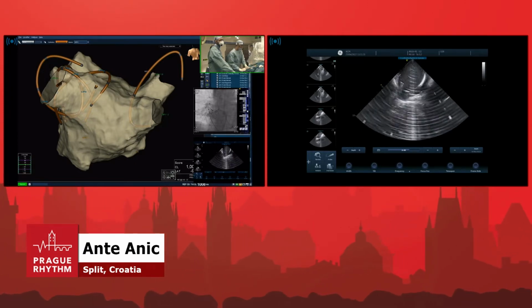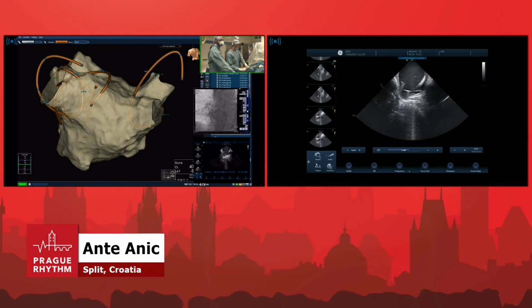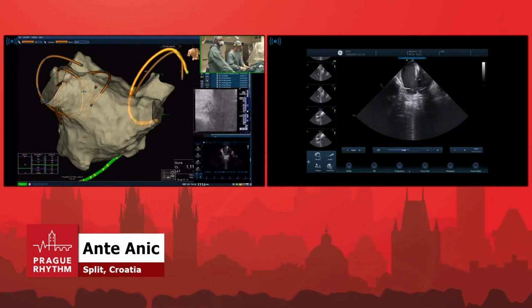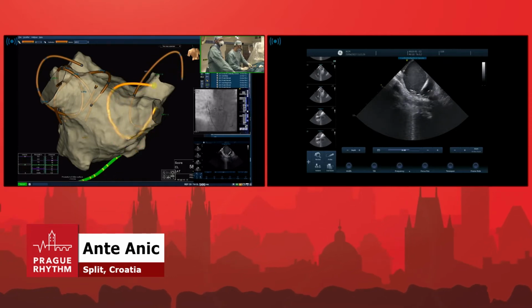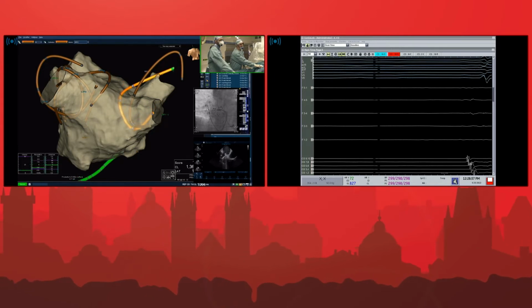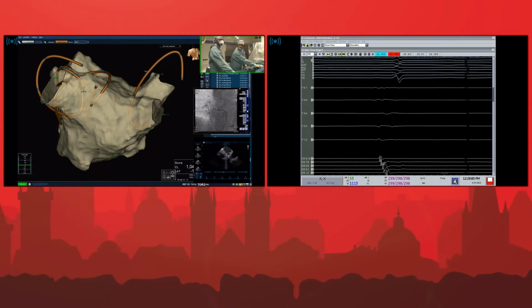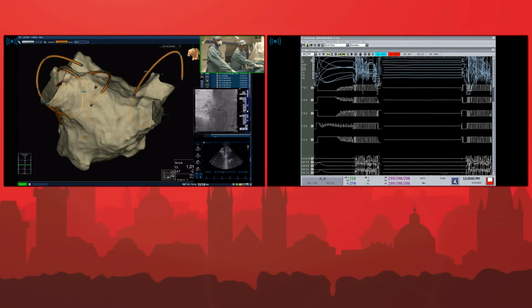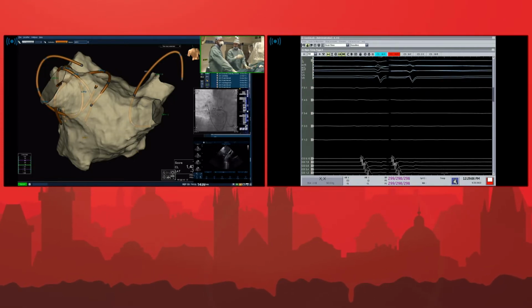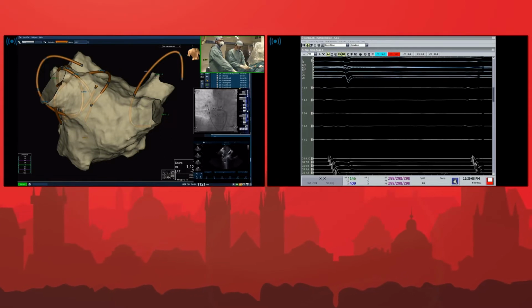Deliver. Okay. Now I have to relax my sheath. I rotate a bit. Good. Let's do this. Right inferior PV. I'm more posterior directed. Go, 3. Good. Now I'm directed a bit more posteriorly, and then we go. Okay. Right inferior PV, pulse 4.